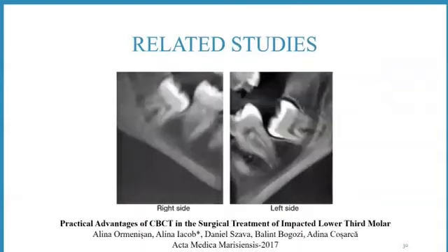This study tried to assess the contribution of CBCT in the preoperative evaluation and further treatment of patients with impacted third molars and mandibular bone with high risk of inferior alveolar nerve injury. Three clinical cases were presented showing positive signs on standard OPG, which exhibited indicators of potential contact between the inferior alveolar nerve and the impacted lower third molars. For an improved exploration, CBCT was used. The study showed that compared with panoramic radiography, CBCT improved the evaluation of the surgical risk and allowed a more accurate planning of the surgery.